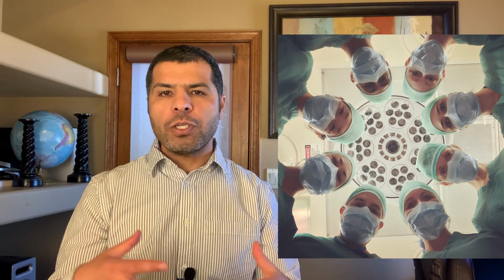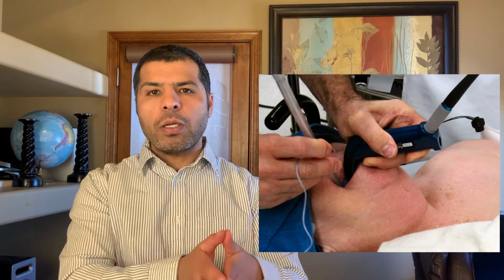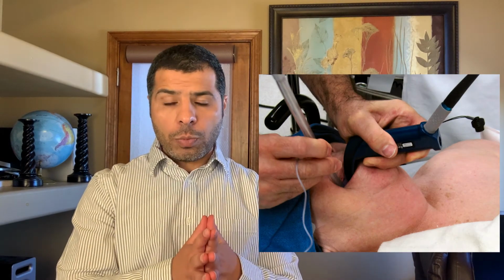It's a controlled setup. You have somebody experienced to supervise you. Most of these patients are healthy to start with. It's the place to start learning endotracheal intubation with direct or indirect laryngoscopies. So that's my advice to you. If you want to start and you can do a rotation with anesthesia in the OR, that's a perfect place to start learning this skill.